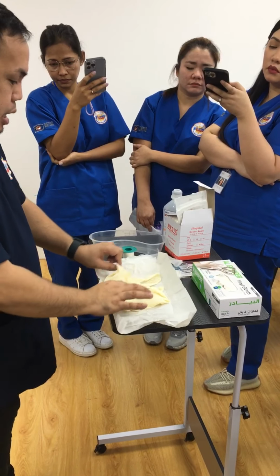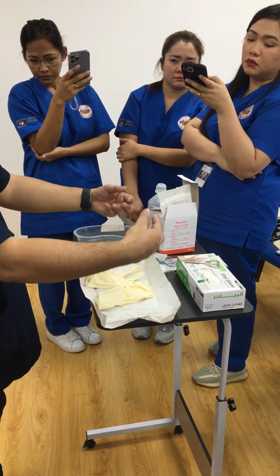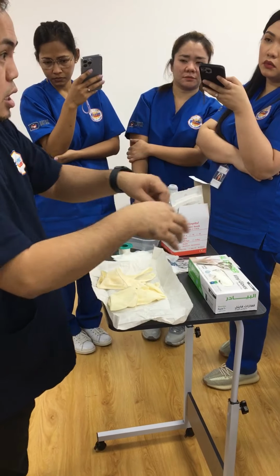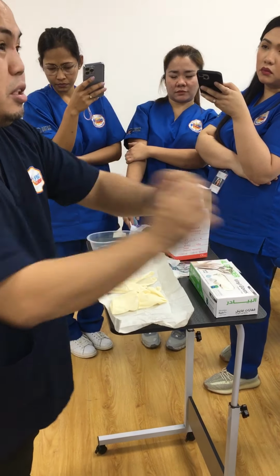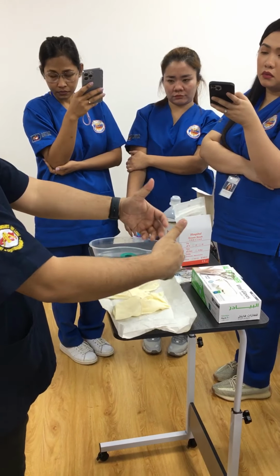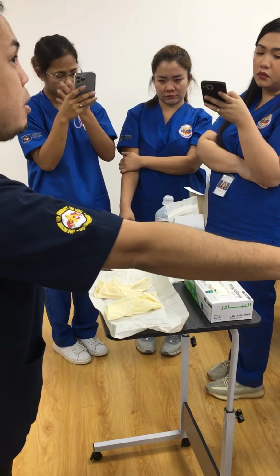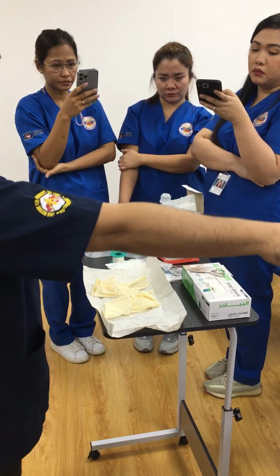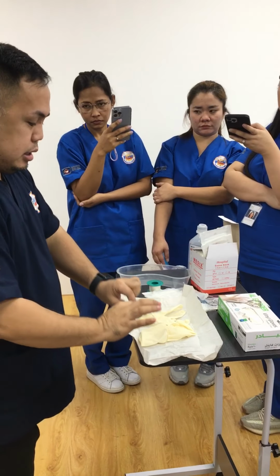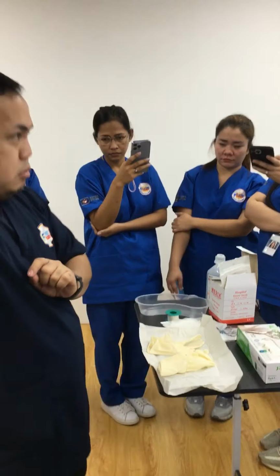And the part of the gloves that is outside is the sterile or the clean, because it will be the one to touch the wound, the skin of the patient. So we make sure that it's not contaminated. So my hands are unsterile, so I'm only allowed the unsterile part. Unsterile plus unsterile is equals to unsterile.